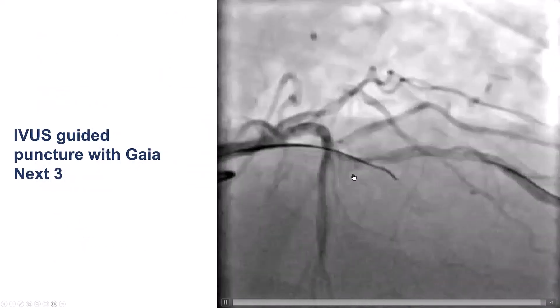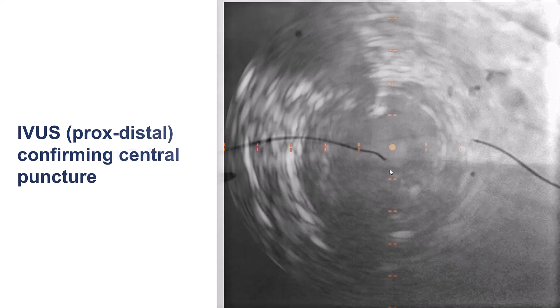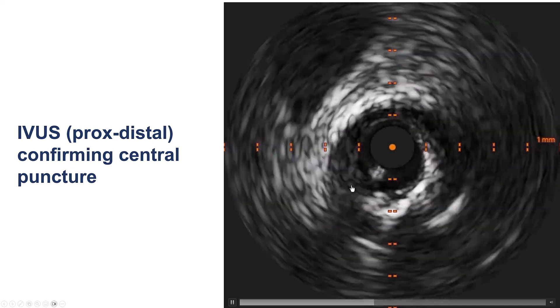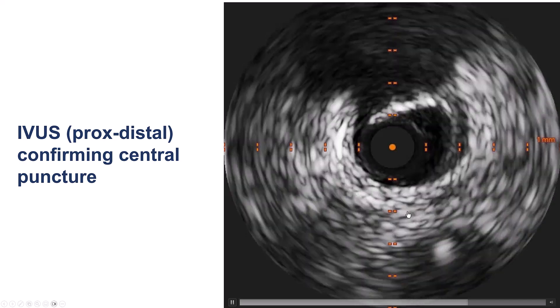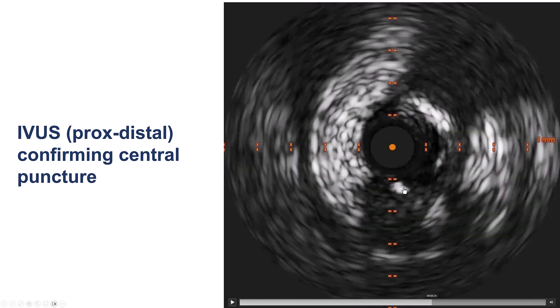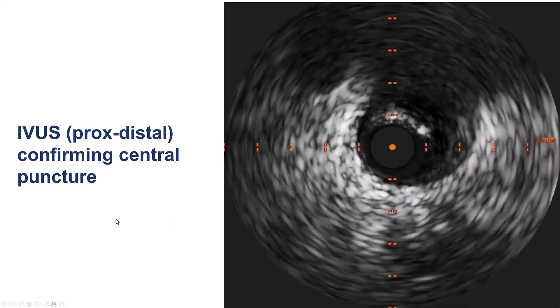Here are the initial wiring attempts. We used the Gaia X3 and placed the intravascular ultrasound catheter in the diagonal branch. IVUS pullback demonstrates, as we come back, that the guide wire is actually entering into the CTO. IVUS can really help us understand where the guide wire is locating, and in this case it is located within the LAD. So we punctured in the right direction.